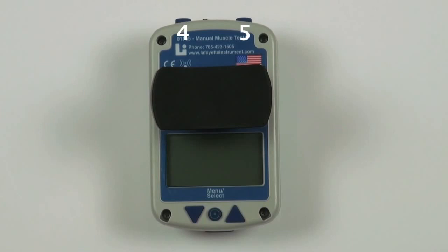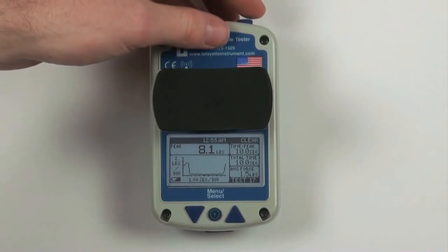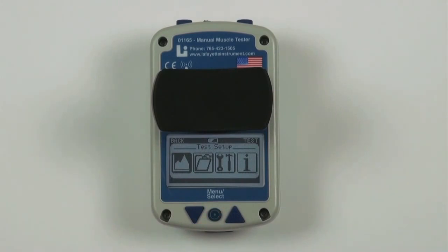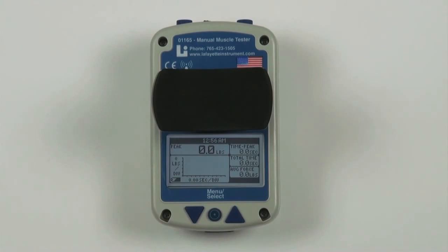Buttons four and five are the top buttons. On the main screen, the top buttons are used to save, clear, and start tests when applicable. On the menu screen, these buttons are used to go back one screen or return to the test screen. These buttons can be flipped for a specific dexterity by changing the button orientation in the settings menu.